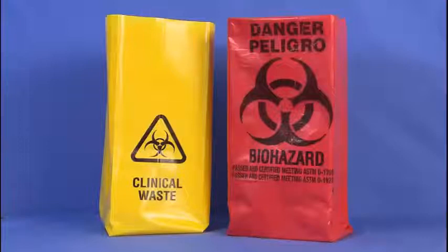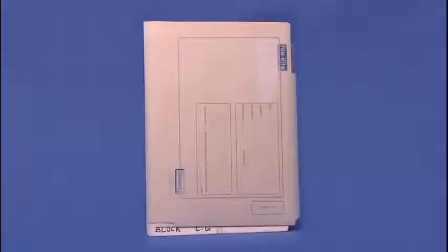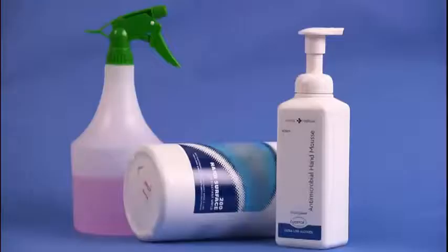While these come in various colors, they can be identified by the universal biohazard symbol. Please check your institution and state regulations to confirm which bag is used. The patient's medical record and cleaning agents.